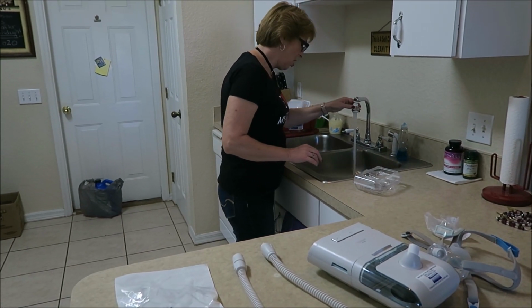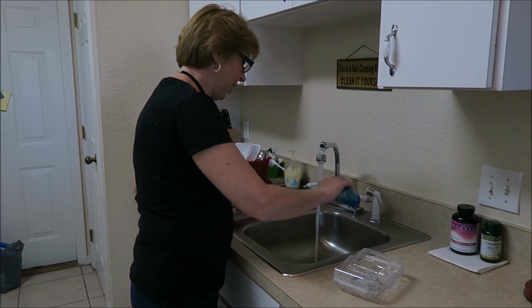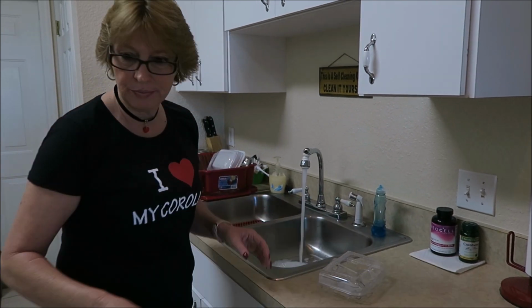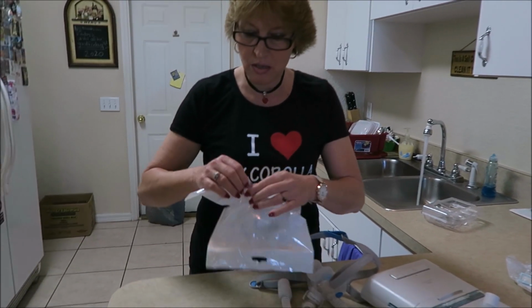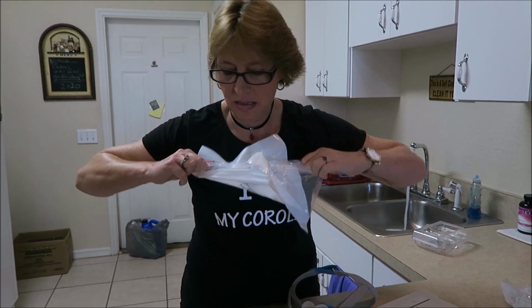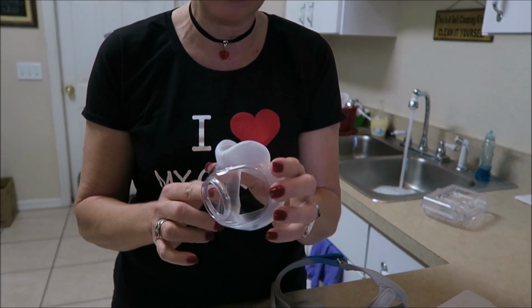My water's getting hot. I particularly use Dawn. Dawn's my friend. It's just a little bit. Let it build up some bubbles. While we're waiting on that, BB is going to open up this thing. This is the part that I have to change once a month on this particular mask.